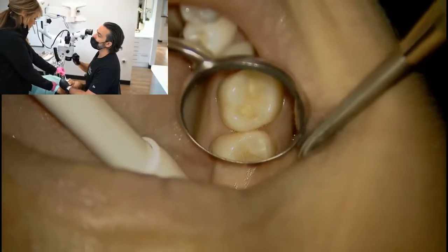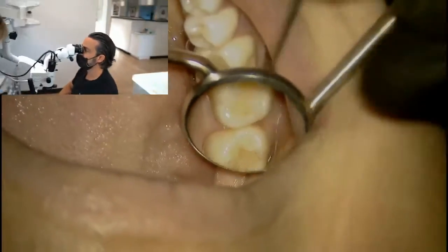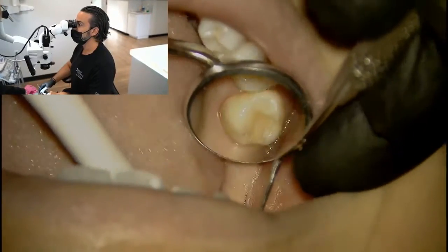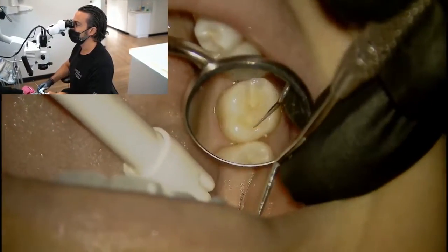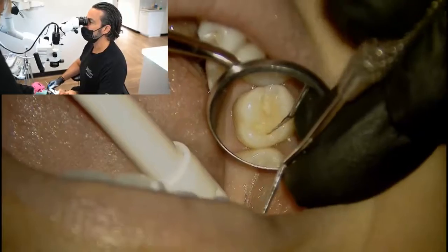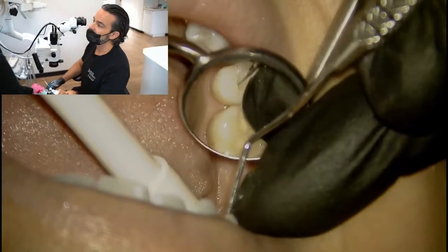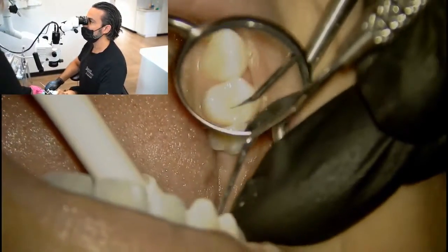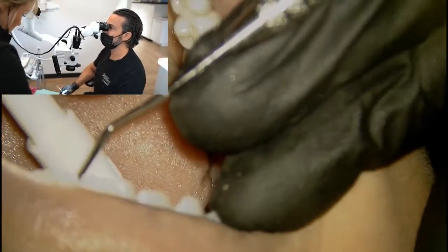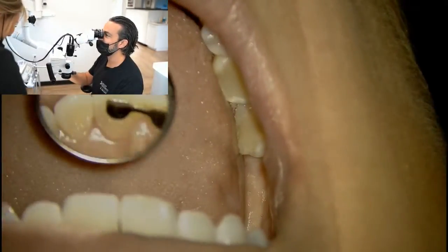Can we turn down the brightness on that screen a little bit? Actually, I'm finding some defects worth fixing here, Miss Lindsay. So, looks like we want to do a little bit of repair work here. Don't you guys worry, I have informed consent going on here. She works for me. Her dentistry's gonna be for free.